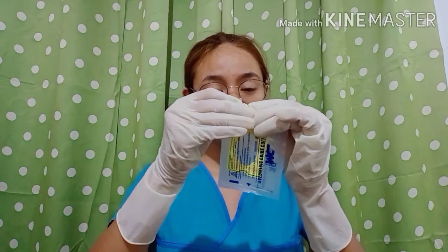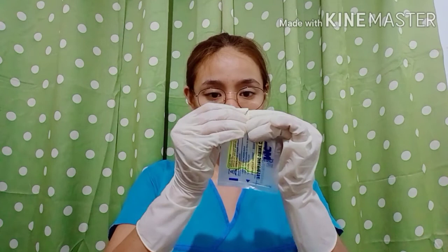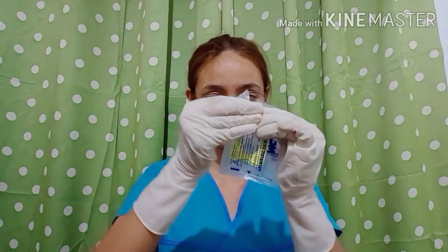And then, don new gloves in preparation for the wee bag attachment. Open the wee bag and peel off the protective paper.